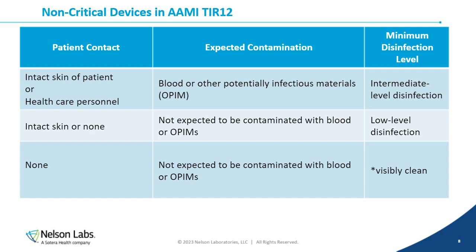And that is in line with some verbiage in the FDA guidance document that I referenced earlier, that from 2015. It does say that there are some instruments that will likely not become contaminated with pathogens, and as such may only need a thorough cleaning and not disinfection or sterilization.